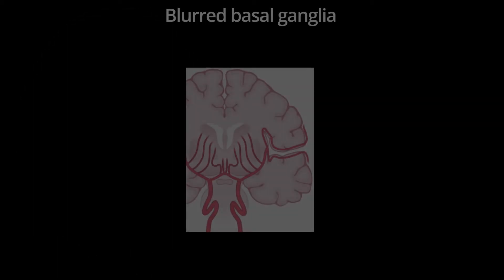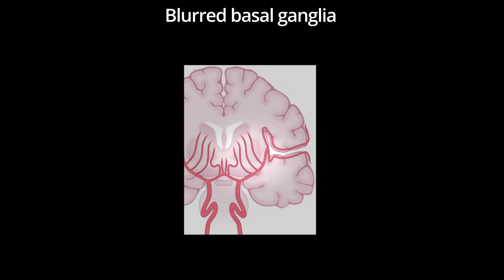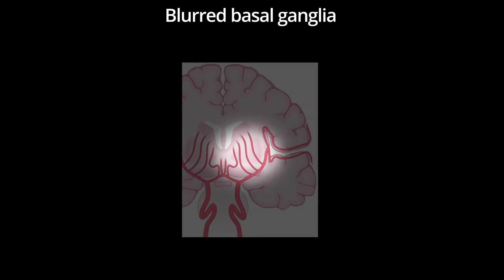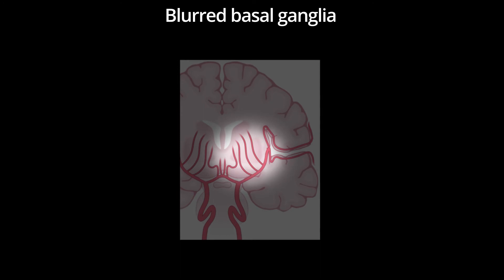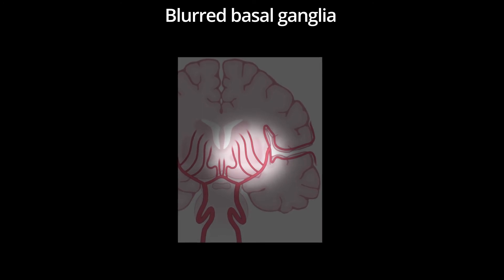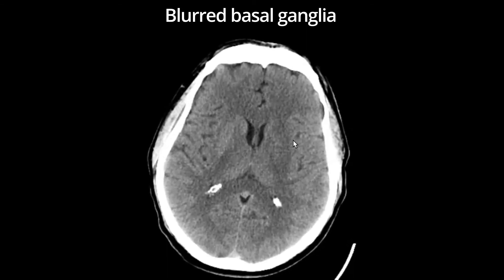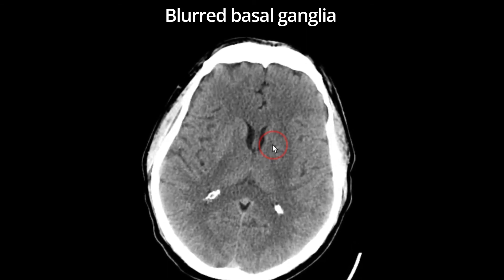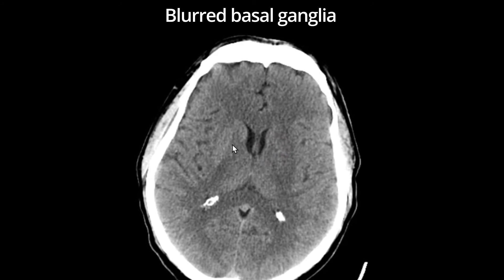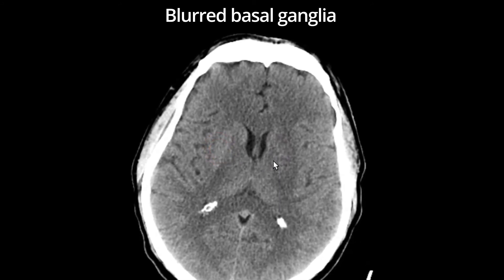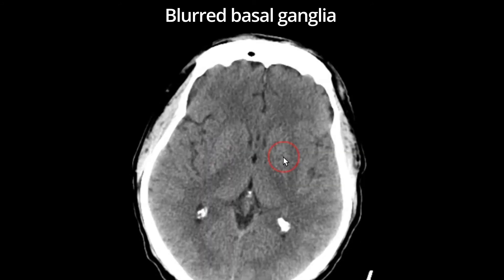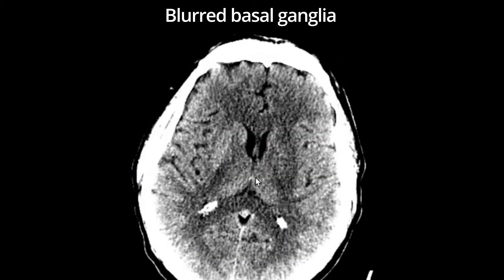If there is a proximal MCA occlusion, then oftentimes the basal ganglia will be affected first, because it is supplied by small lenticulostriate arteries, as shown here. These arteries are end arteries, which makes them particularly sensitive to decreased blood flow. Here is an example of left MCA ischemia, resulting in a blurred left basal ganglia outline. Compare the left basal ganglia to the right — the left is poorly defined and has areas of low attenuation. These findings are more obvious on the stroke window. Always use your stroke window to help find subtle findings of ischemia.